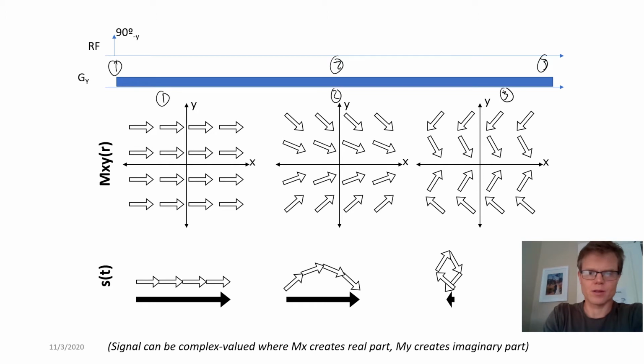So have a little slow accumulation, larger accumulations the further away we get from the origin, and continued rotation over time. And hopefully this should be a review of some of the prior concepts we've covered.